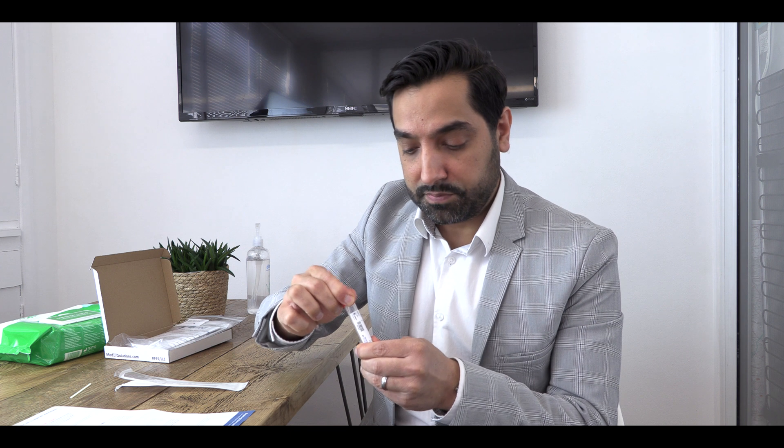Make sure it's tightly closed and secure, and then if you can, write on the test tube the date and your details. This completes your sample collection. You'll now need to follow the instructions in your pack so that we can receive your sample and get you your results as soon as possible.